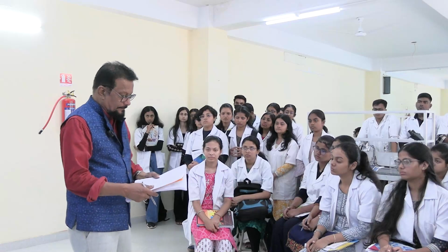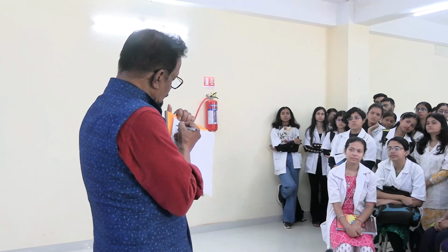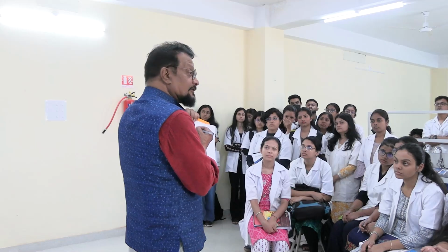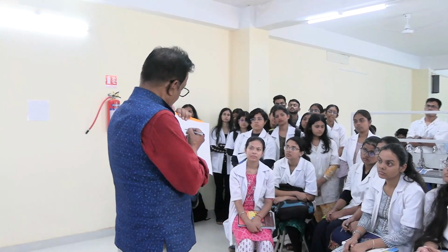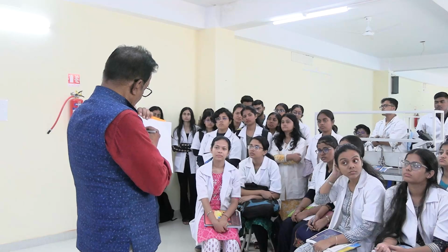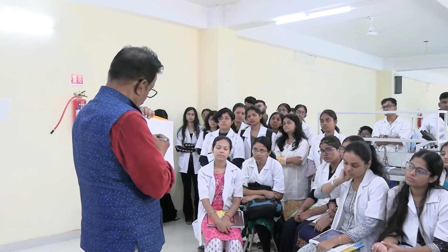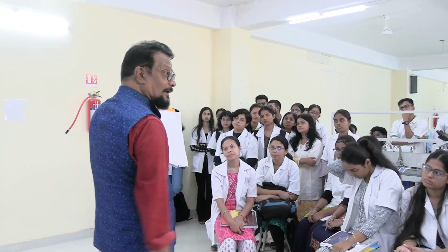How will you do it? It's like this only. Instead of this 2, we'll write here N for neutrophil, E for eosinophil, B for basophil, L for lymphocyte, M for monocyte. Total number: how many? 100.